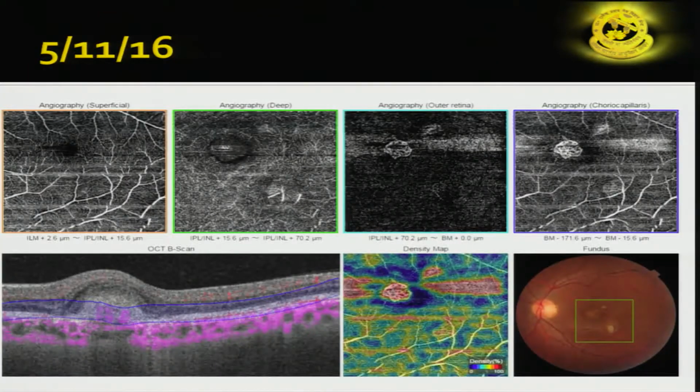And so this is another patient I am showing you. He had already been treated outside and had a vascular network here, but now again for the past 3-4 months he was asymptomatic. He had just come for a second opinion and sort of a review at a different place. So this network looks quite significant here. Should I treat it? No fluid on OCT. Patient is not symptomatic. We discussed with him. I told him we have both the options. At present, the patient opted for waiting.